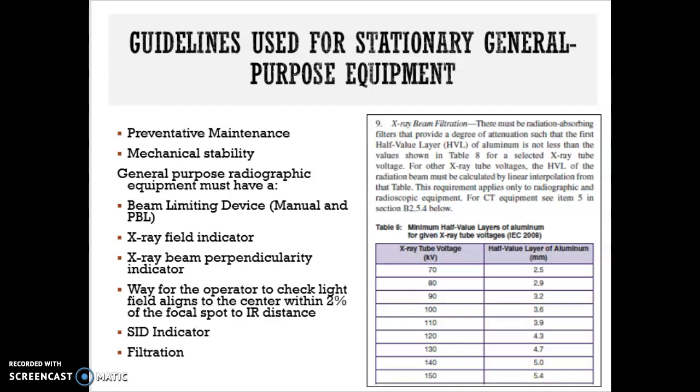If you think back to your image recording course that you did last semester, this links to linearity and reproducibility. If you remember, linearity in radiography is the production of a constant amount of radiation for a different combination of milliamps and exposure time. The assumption is that an increase in mAs should produce a proportional increase in radiation exposure within 10%, and if the X-ray unit is not functioning correctly, the unit must be serviced before being used again for diagnostic procedures.